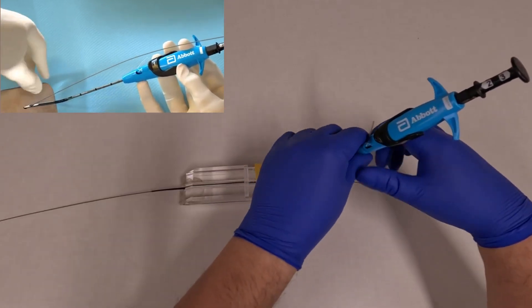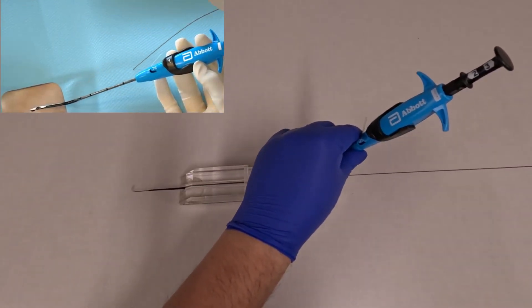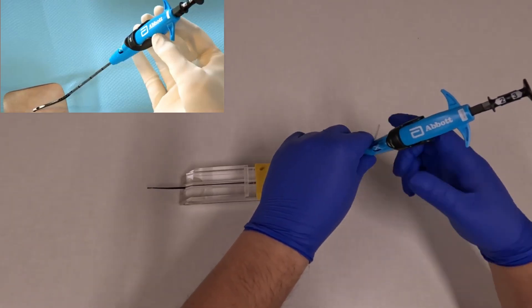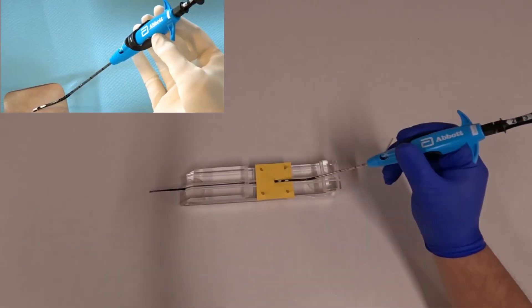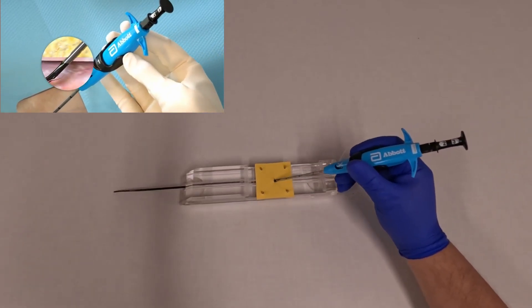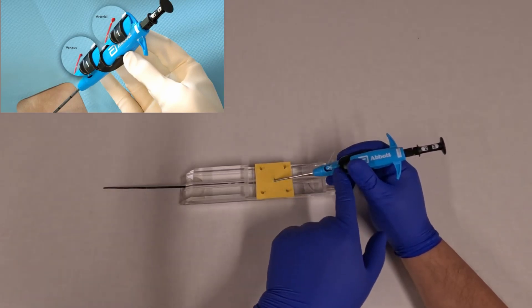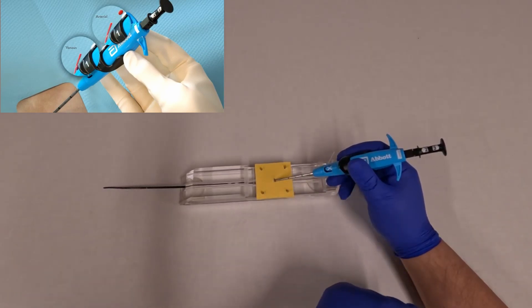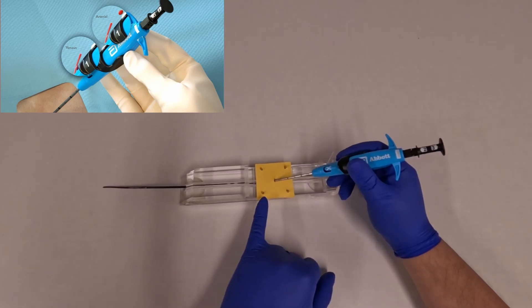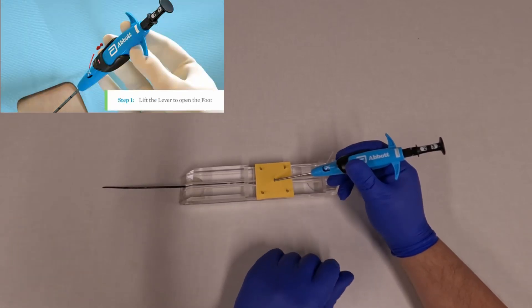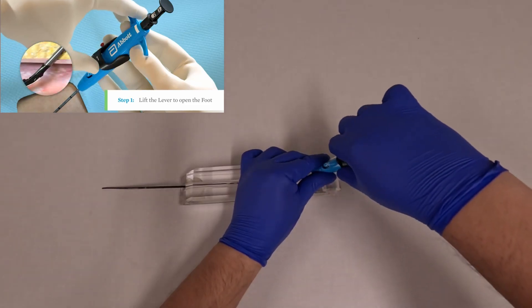You're going to advance just until the wire port is outside the skin. Then you can remove the wire. You advance the Perclose into the lumen until you get blood flow coming out of the side port. This means that the device is fully inside the lumen. You'll see pulsatile flow with arterial access and a slow darker flow with venous access.